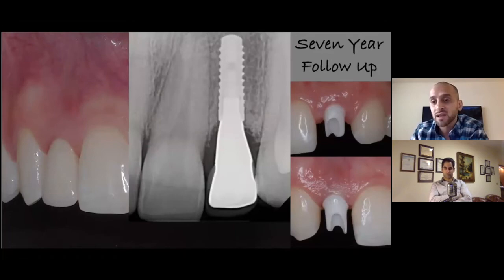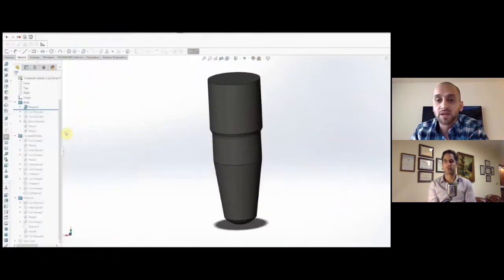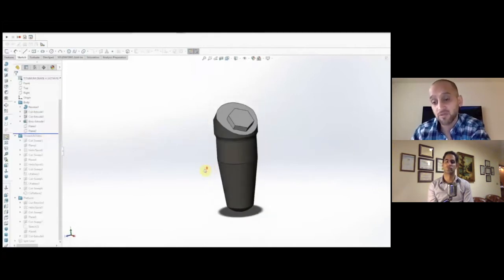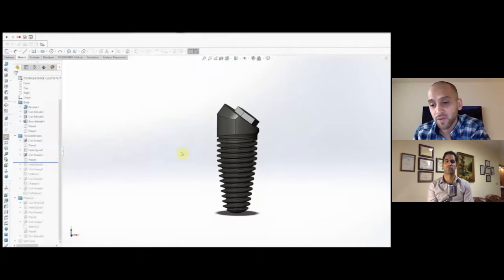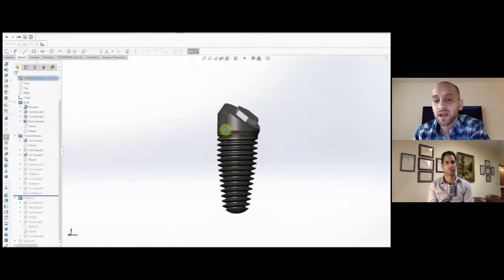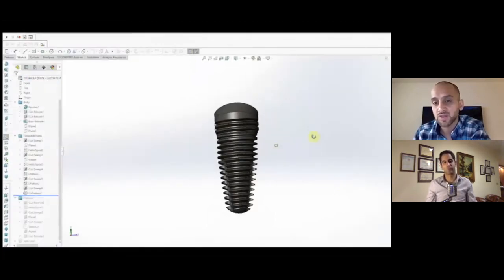But as you can see, fabrication of these abutments can be very difficult. We need to work with technicians who understand these concepts. We need to work with technicians who understand finish line margin placement. So it's very important. So that's why I think these fixtures are very important because they have really solved that situation for me personally. Like I said, these are not the only fixtures that I place. I do place straight implants, but in areas where anatomy gets in the way of achieving screw retention, I think these fixtures are very, very important because they enable you to have a nice surgery, good primary stability, and screw retention at the same time.